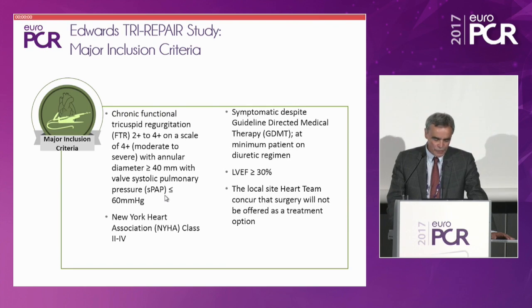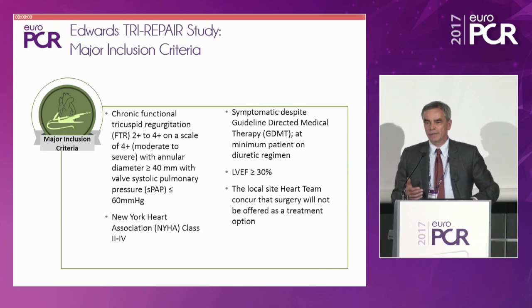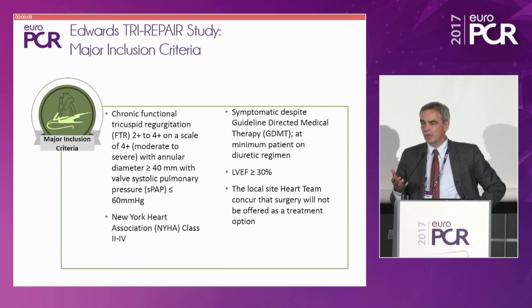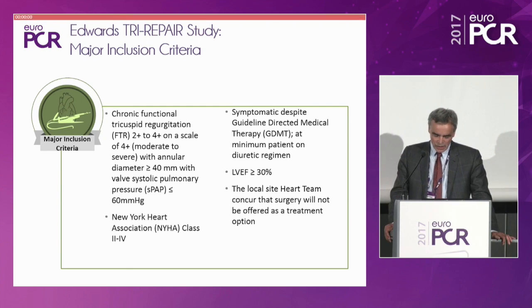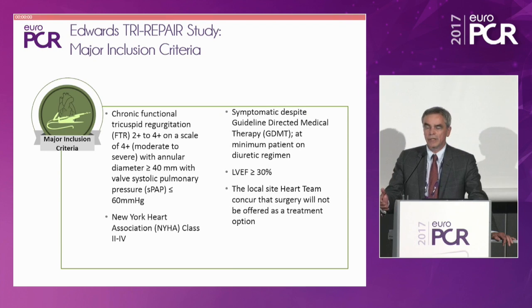Now again, if you have a right ventricle that can give you 60 millimeter mercury, it always tells me that you have a good right ventricle. So I'm more scared if the pressure is very low in a patient with a very poor RV function, because I think that these right ventricles fail much more often, or at least have the risk to fail, in contrast to a right ventricle that over time is able to provide a pulmonary hypertension. So I'm sure that we have to learn whether the 60 millimeter mercury is really the right exclusion criteria, or whether the 20 millimeter mercury in a poor RV function should be the exclusion criteria. That's something that at least I would challenge.